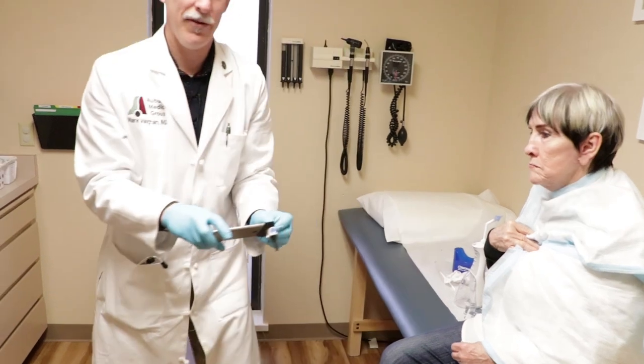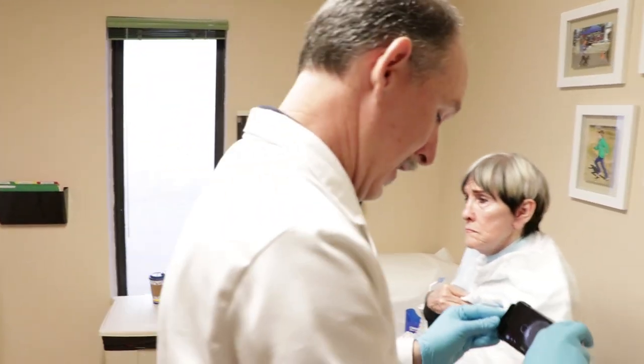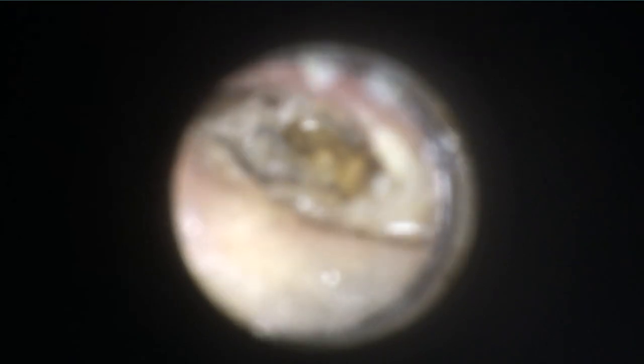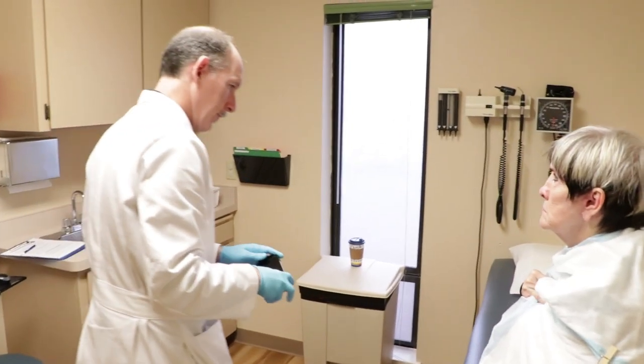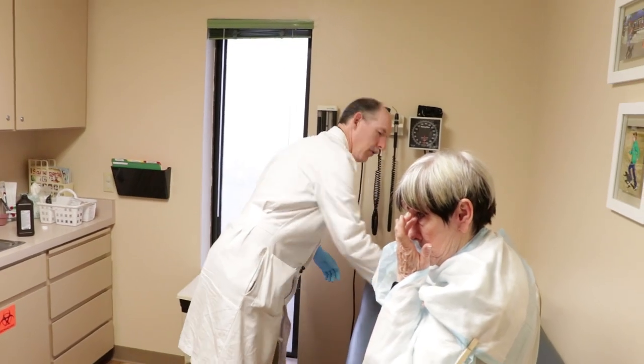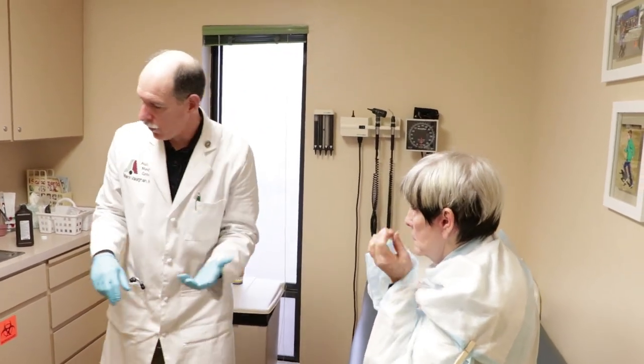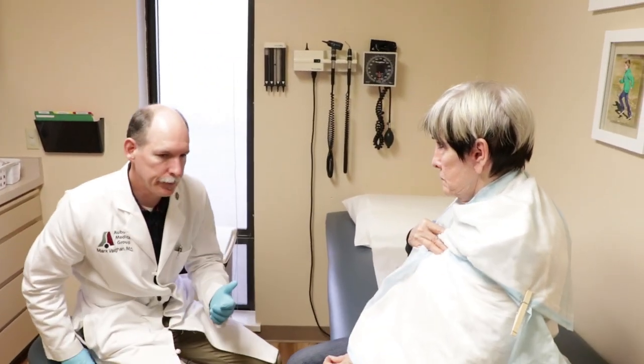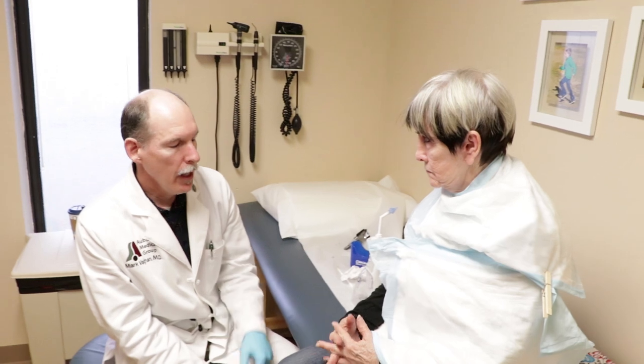So we're going to call this after seven washes — that's a lot. The floor is all sticky. This canal is shaped differently than the other one, and the doctor earlier had mentioned that. Given what we've done here, I think I'm going to recommend that we don't continue with the washing.